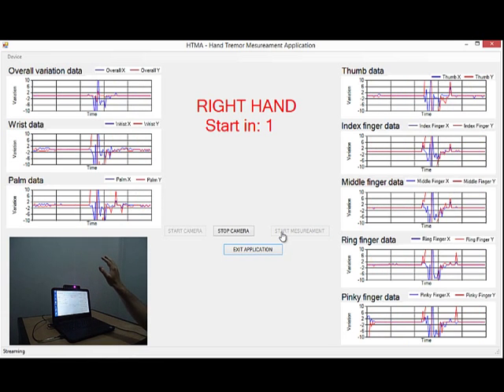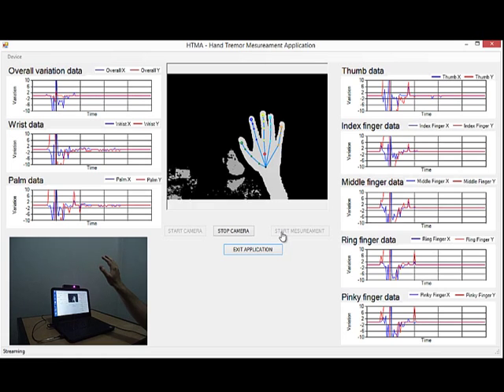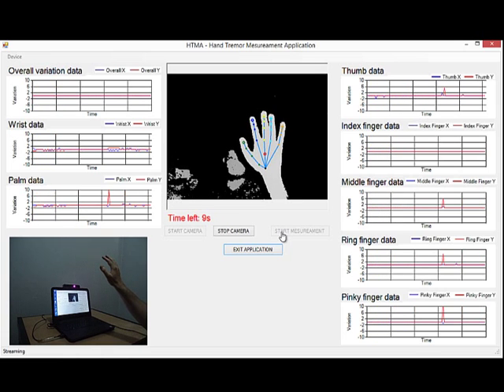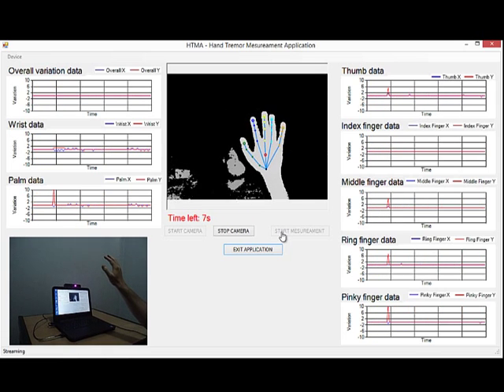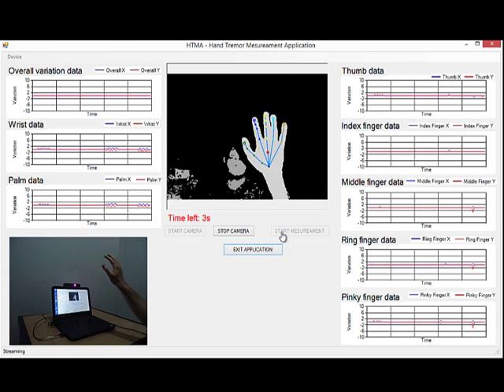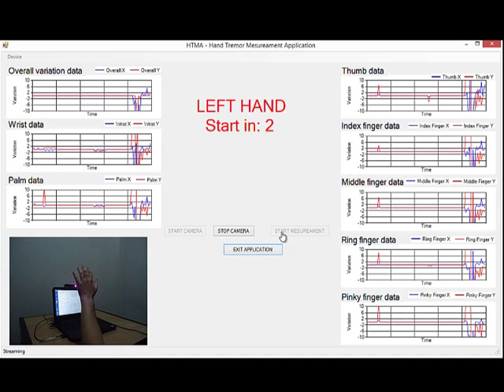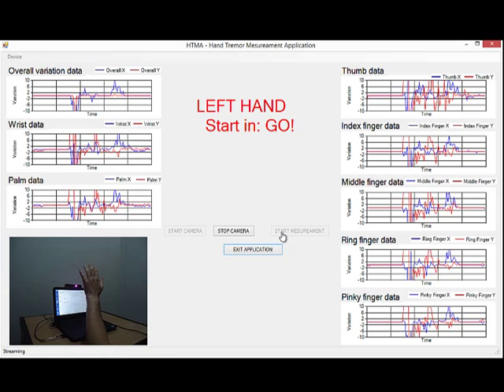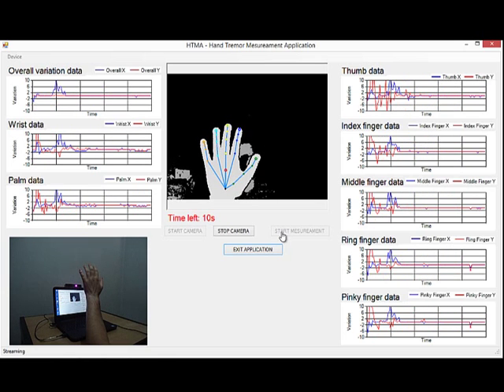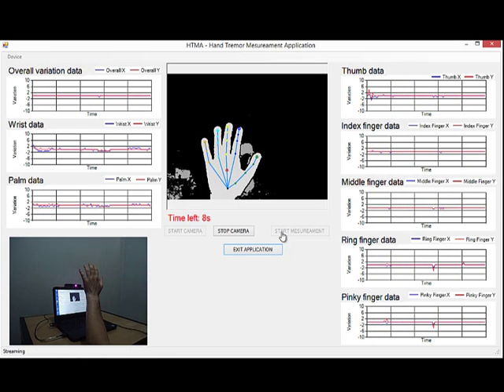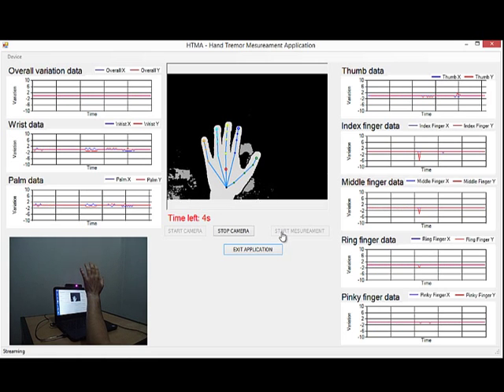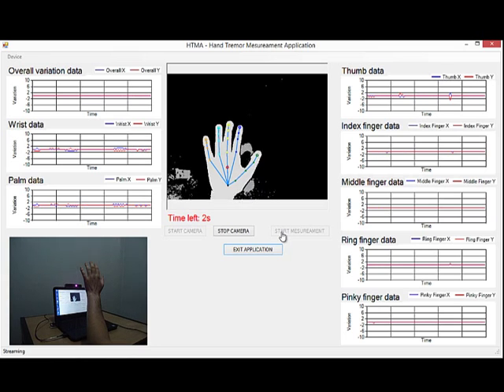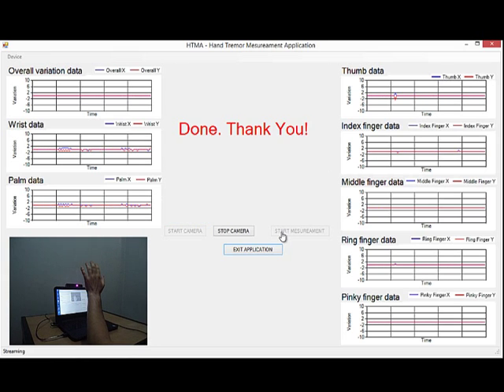A 3-second message asks for the right hand first. The user must try not to move their hand and fingers for a 10-second period while the data is gathered. Next, another 3-second message asks for the user's left hand. Again, the user must try not to move their hand and fingers for 10 seconds. After the second period, a message informs that the measurement is done.